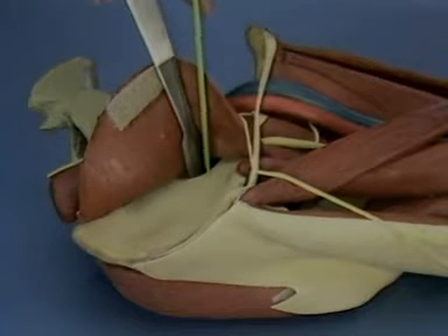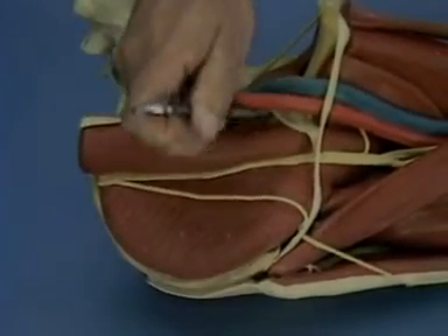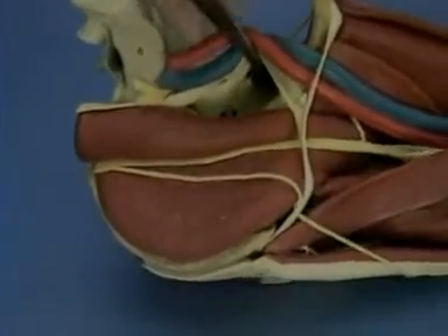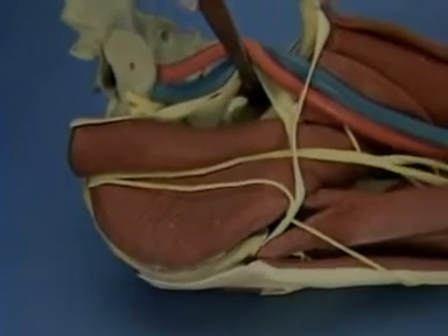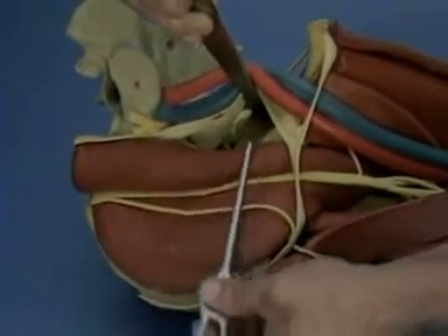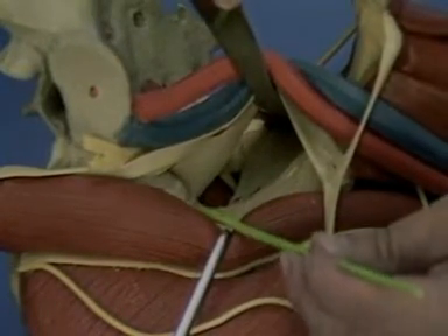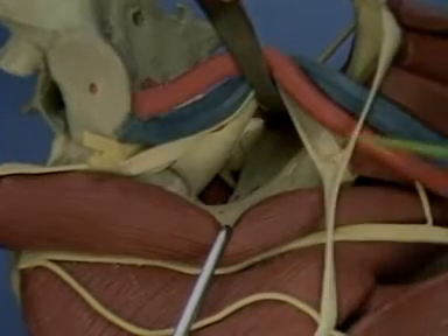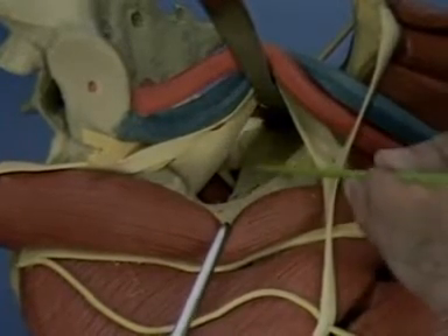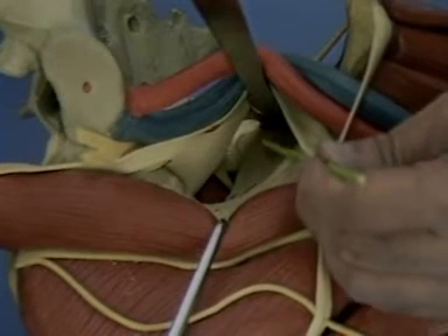To create the second window of the ilioinguinal approach, the femoral vessels are retracted medially. The iliopectineal fascia is detached from the pelvic brim and the obturator internus is elevated from the quadrilateral surface. The ilioopsoas and femoral nerve are retracted laterally. Through the second window, we have exposure of the pelvic brim from the anterior sacroiliac joint to the superior pubic ramus. The quadrilateral surface is visualized with a retractor placed with the tip near the ischial spine.